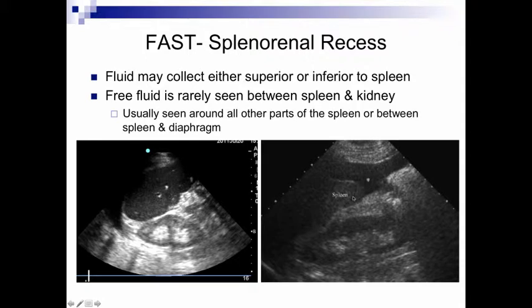And again, just as it is true for the hepatorenal view, you want to fan the probe through in order to view the spleen in more than one position to make sure you're not missing a smaller amount of accumulating fluid.